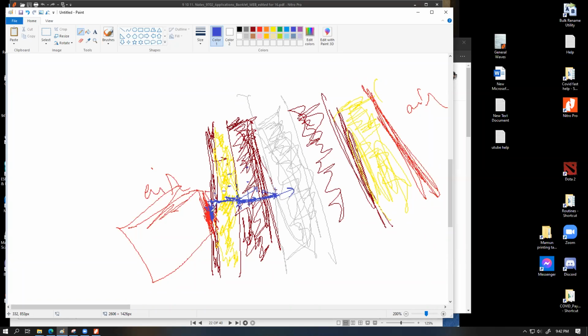So how thick is the fat layer, or what kind of fat is there? Is it soft fat or is it hard fat? And how big is the muscle layer? Is it solid muscle, or is this muscle filled up with fat, with fascia and other stuff? So we can have precise information about what medium is present at certain locations and what the dimensions of those locations are, or what the locations of these exact reflection surfaces are, where the medium changes occur every single time the medium changes. Each of this information will be fed back to the machine.